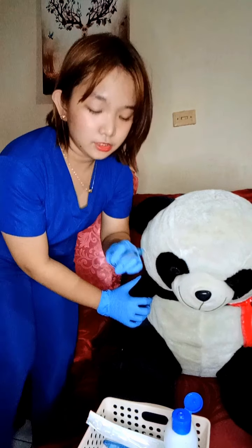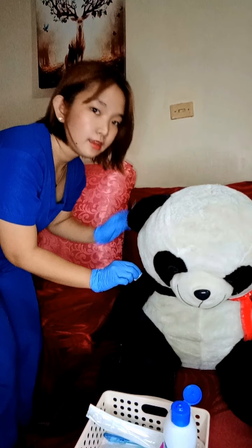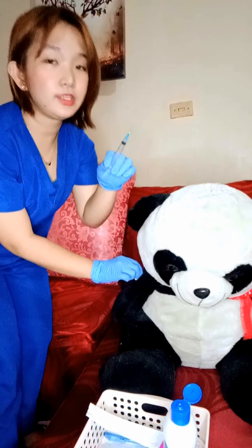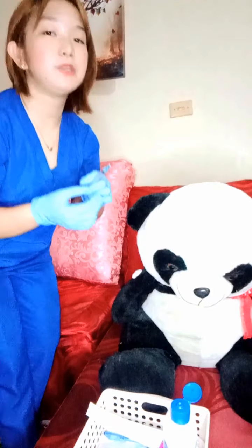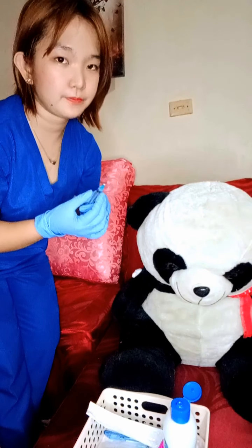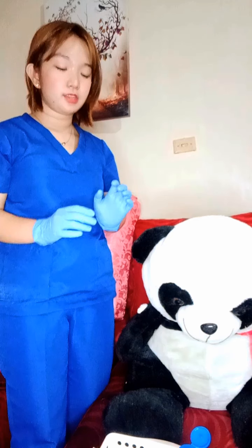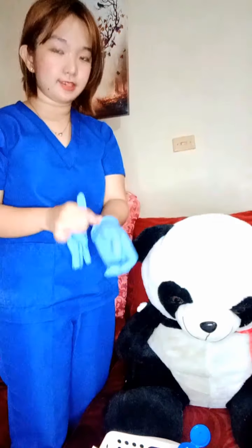Get a dry cotton swab and apply gentle pressure to the site. It is a must not to massage the area, only apply pressure. Also, do not recap the used syringe. We have safety precautions for hazardous medical toxic waste, so we can now dispose of it. Once you've done administering the intramuscular injection to the patient, you can remove the gloves and wash your hands.